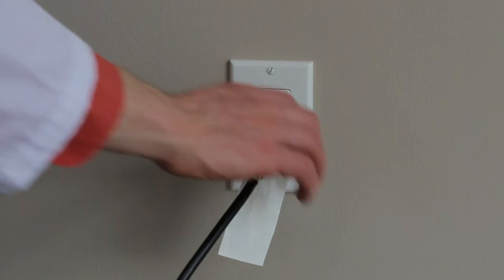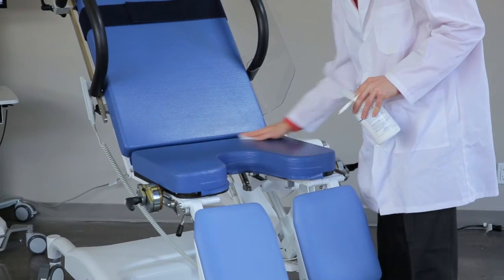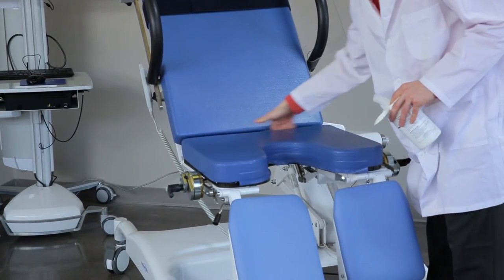Unplug the table from the power source before cleaning. Do not use steam cleaning. Household cleaning disinfectants, as well as hospital grade disinfectants, are recommended for use on the table.